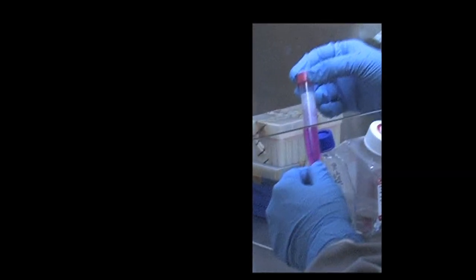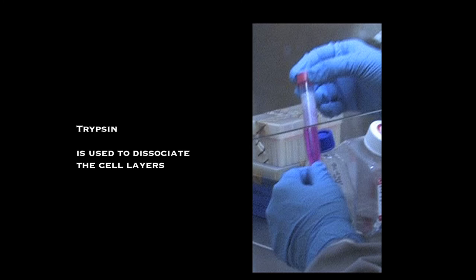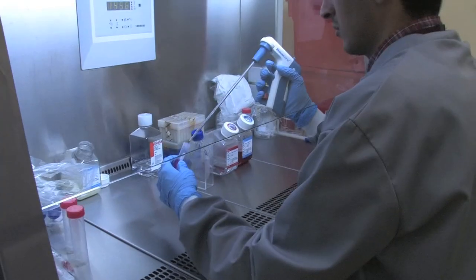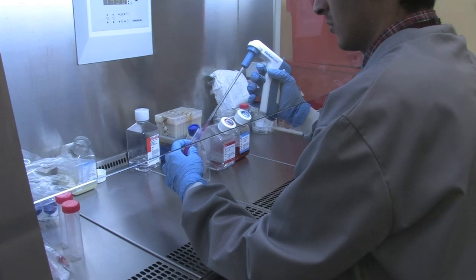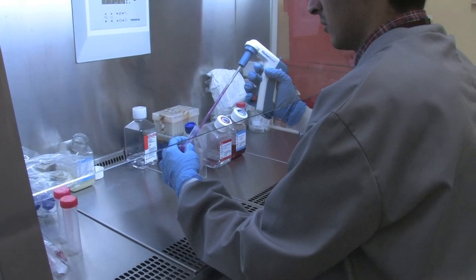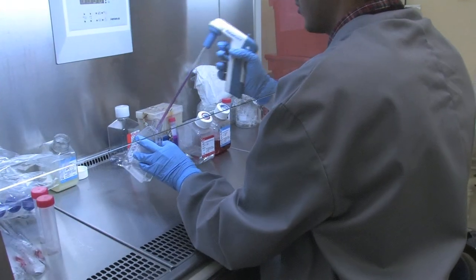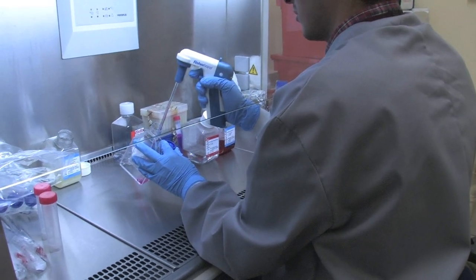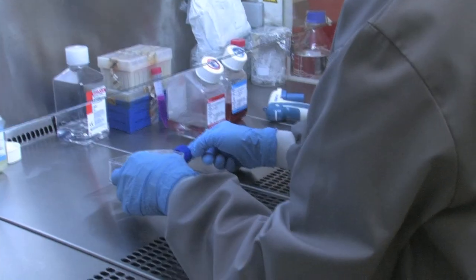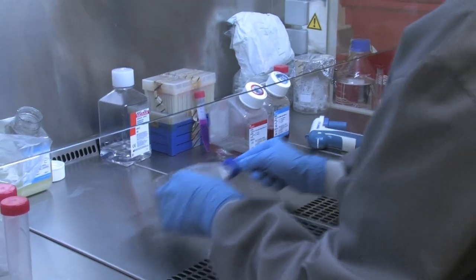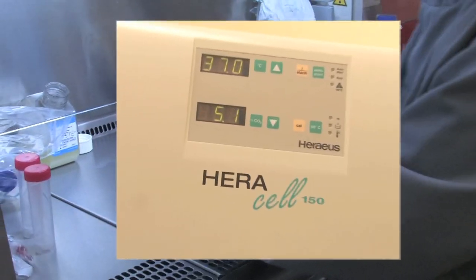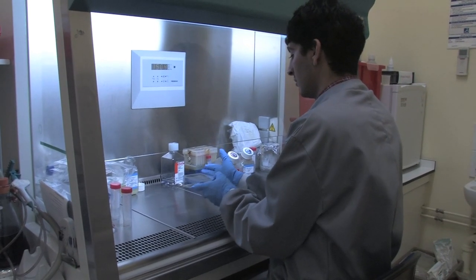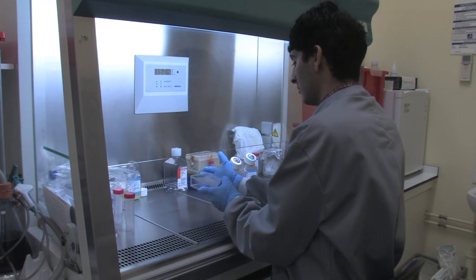Pre-warmed trypsin is then added to the attached cell layer. Approximately 2ml of trypsin per 25cm² culture surface area should be added. The flask is then placed in a 37 degrees incubator for 5 minutes. The flask may be tapped gently in order for the cells to detach.